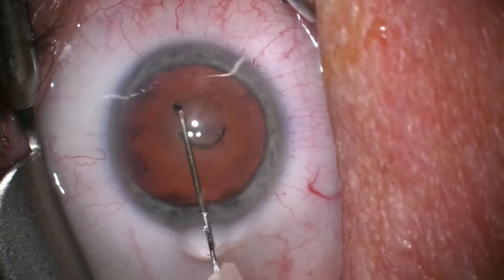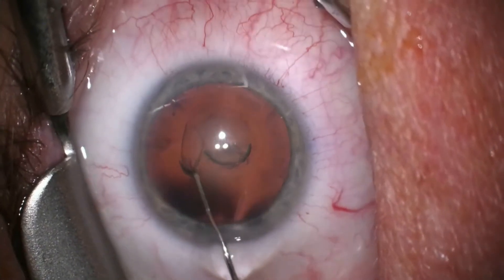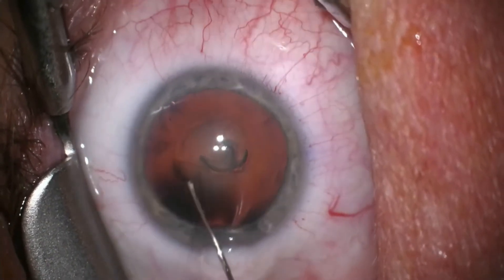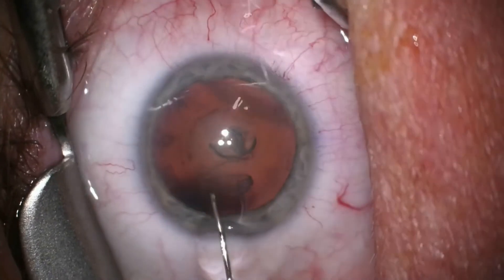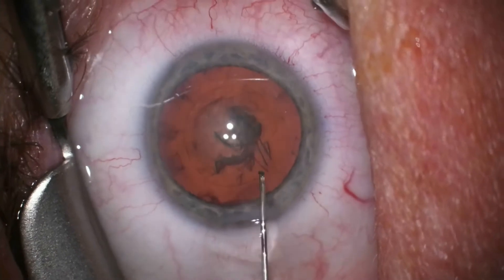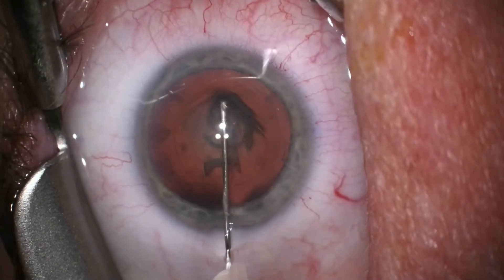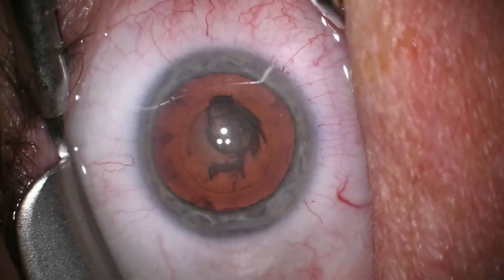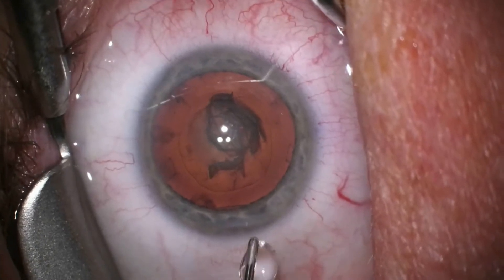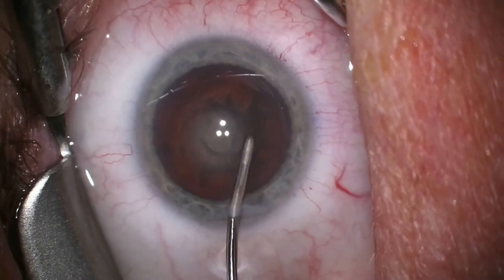Here you can observe me carefully making a circular opening in the front capsule of the cataract. The cataract consists of a harder nucleus and a softer peripheral material known as cortex. These are surrounded by a clear cellophane-like membrane known as the capsule. Our goal is to remove the nucleus and cortex while leaving this delicate capsular sac intact, which will later hold the lens implant.